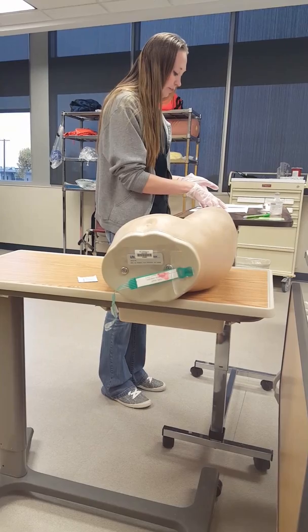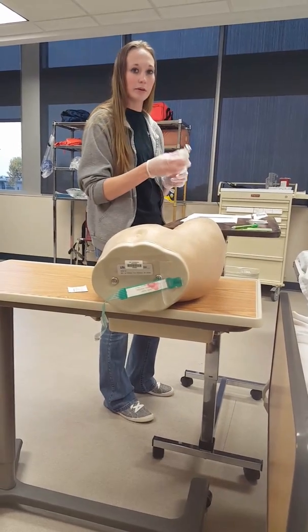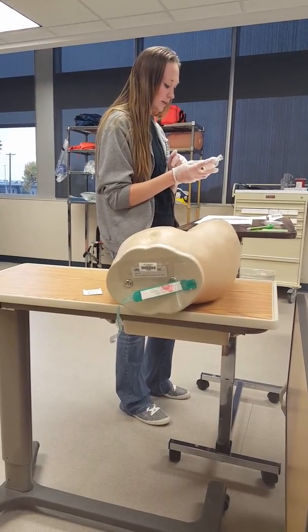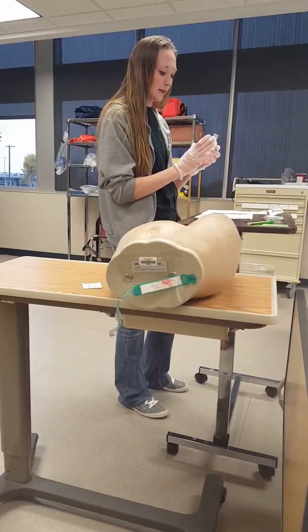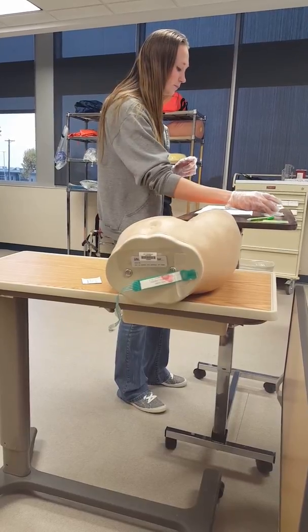I can give it to you every 4 hours, and your pain you said was 8, so that looks good. Then I would look at my vial, and it says Demerol, 100 milligrams every 4 hours for pain, PRN. And the date is good, and the integrity of the bottle is intact, so there's nothing wrong with that.